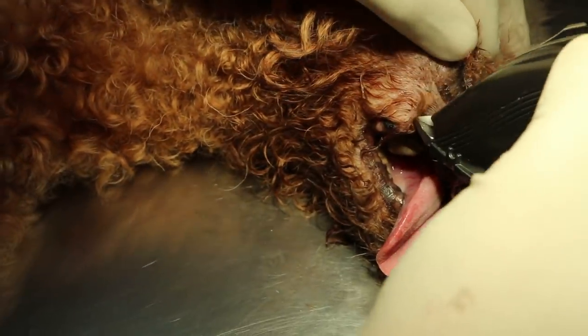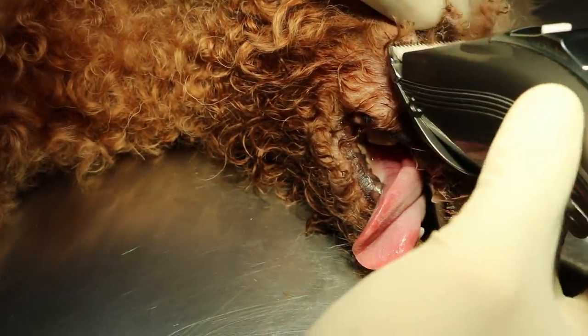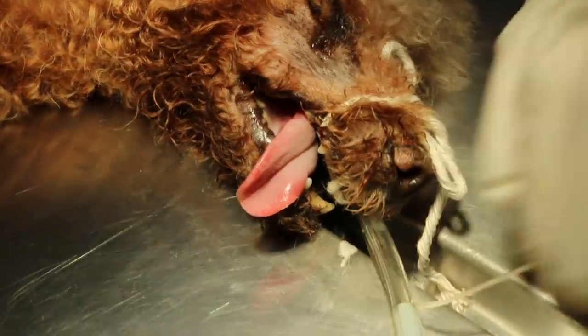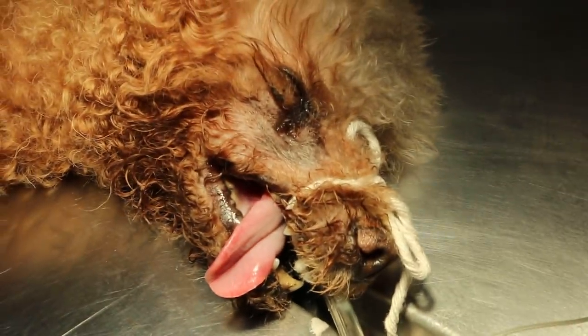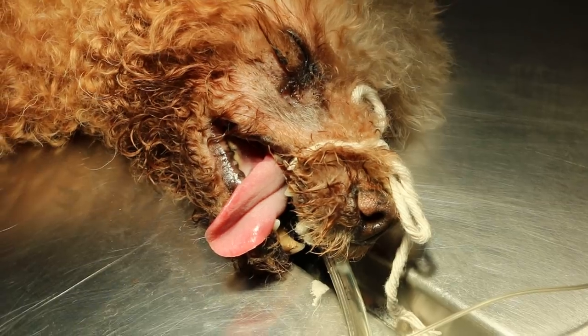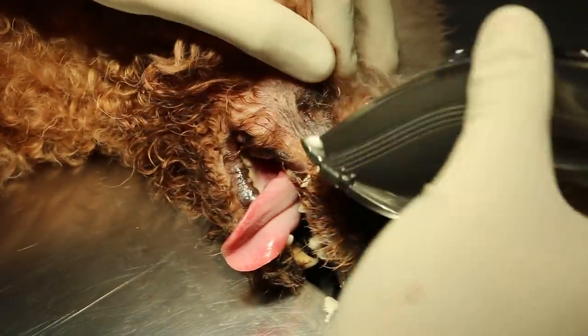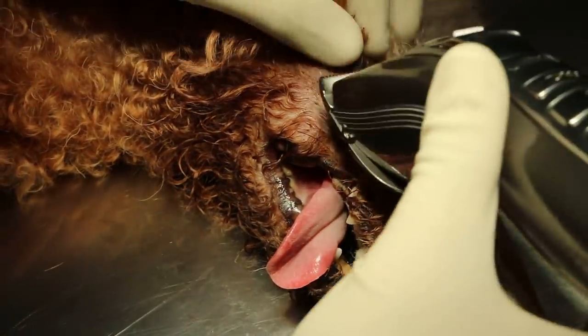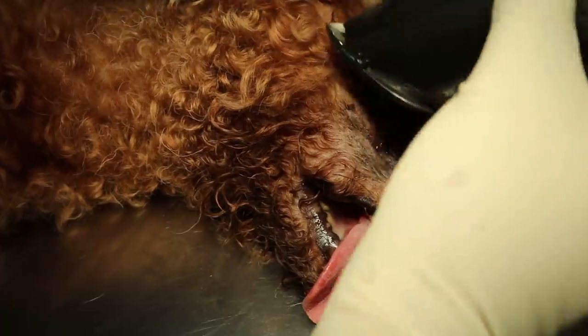Okay, now we are shaving. How old is the poodle? Six years old poodle with a wound below the right eye. Now this wound is actually an oral-nasal fistula and it will never heal because it's discharging pus from below the premolar 4 root.